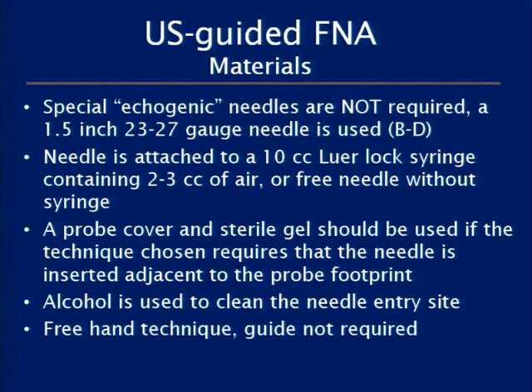And you don't need any special guides. A freehand technique is just fine. You can just move the needle up and down within the nodule and then prep the sample, which Dr. Massoll will go over.